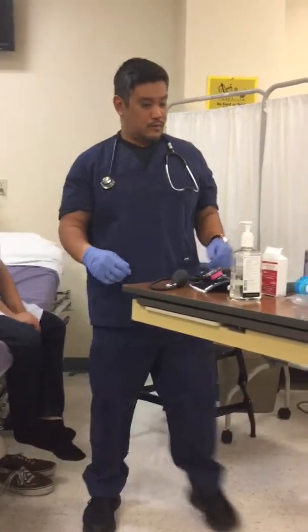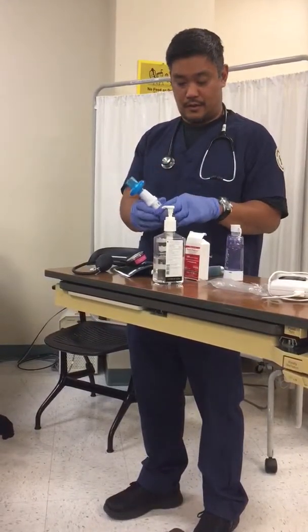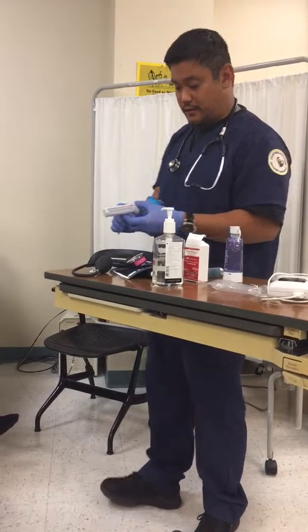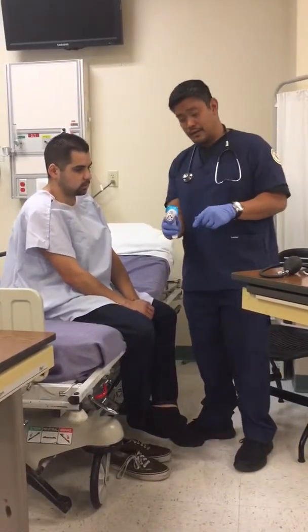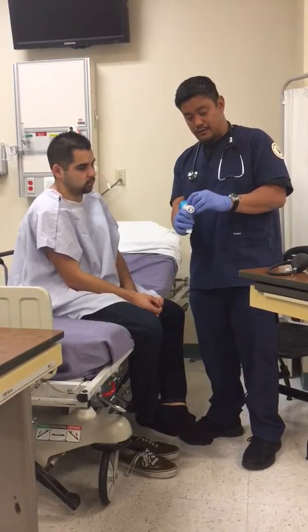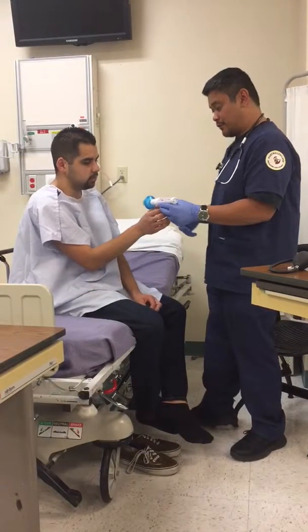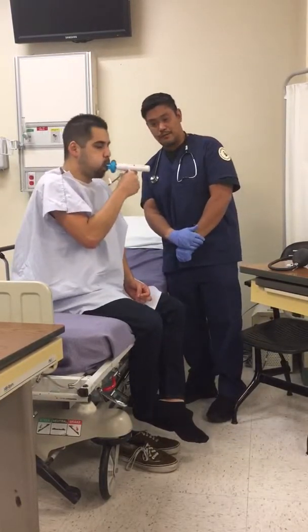All right. So I'm going to do this once more. So like before, we're going to blow out as hard as you can. Try to reach your goal right over here. So we do this 3 times. So you go ahead and do this for me. Take a deep breath in and blow.